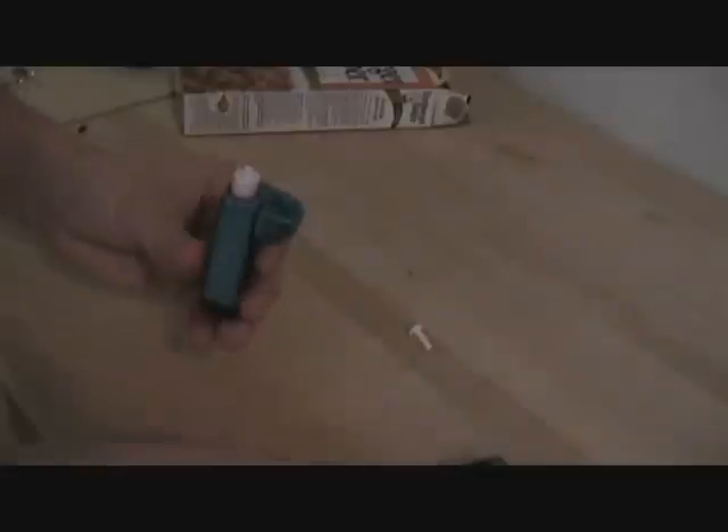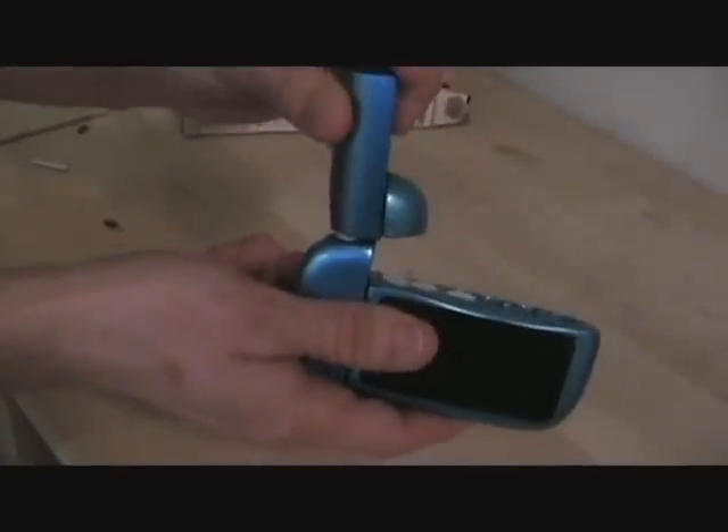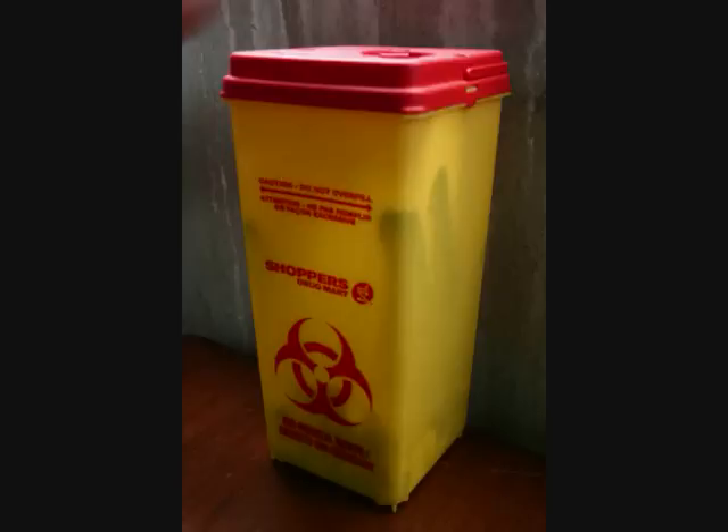Once that's done, the user then snaps the pen fill needle off into the sharps container, and then the insulin pen is attached back onto the device. Once the sharps container gets full, it can be detached to see how full it is, and by dragging the slider down, the used needles and strips should come out into a large sharps container such as this one.